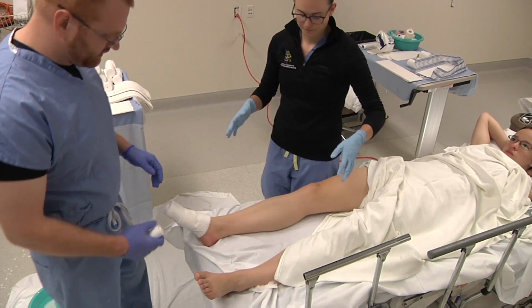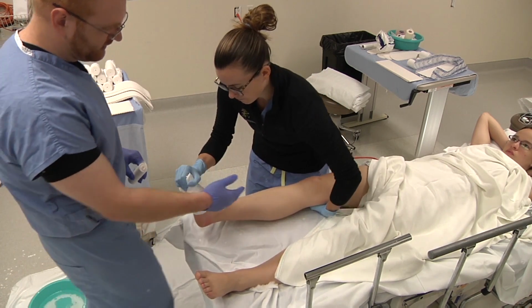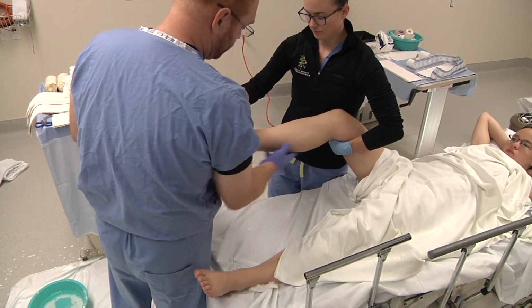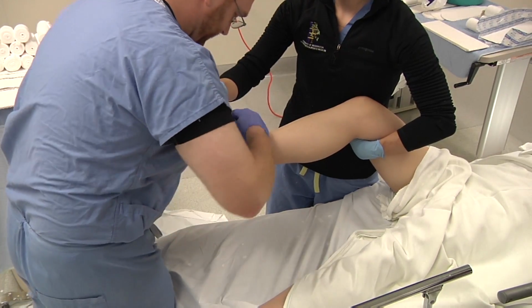Next, you can have your assistant come in and elevate the leg. Generally, we grasp around the toes as well as underneath the medial thigh, bending the knee to take any deforming forces by the gastroc soleus out. Next, we work our way up.